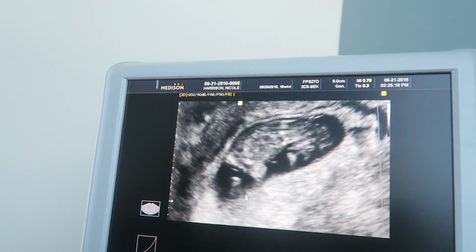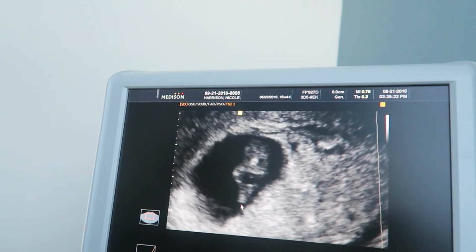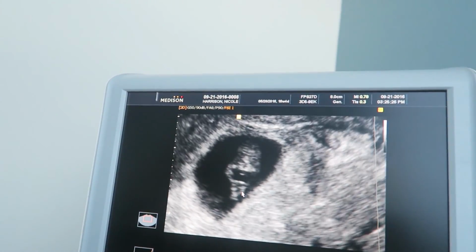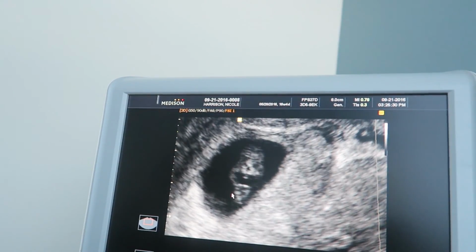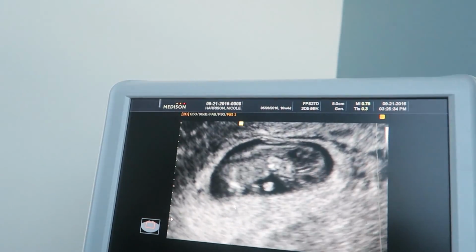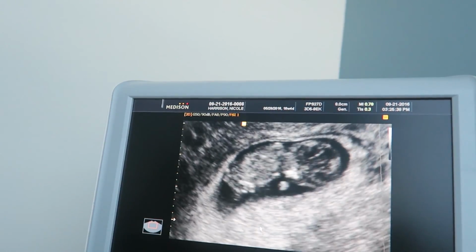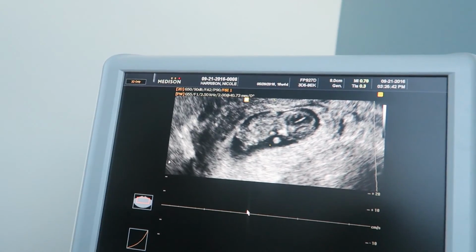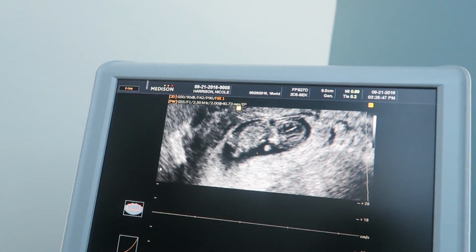That's that cord. And then the arms and legs start off kind of short, and they're real skinny. So here's the two legs that are kind of coming out. And at this early stage, they're kind of bow-legged, and they almost touch at the feet. Can you guys see the two little legs there? Swing back around. And it's an embryo, so I'm going to put a cursor in the chest. That's interesting, the information you have. Yeah, it's amazing. You can tell all that. Well, yeah, there's different things we look at at different stages.